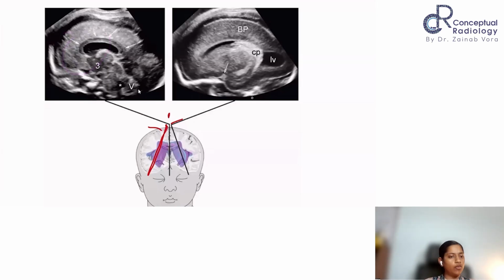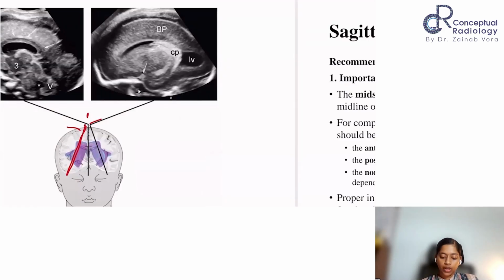Very good. So anterior fontanelle or sagittal suture. Now this is through the sagittal suture. See, they have applied slight pressure. When you focus, there is indentation of the bone. So anterior fontanelle or sagittal. The anterior fontanelle will give you very good images. Sagittal will give you a broad picture, again with very good imaging, and the posterior fossa is also somewhat seen. But for the posterior fossa, we'll focus through the posterior fontanelle. Then you get very good quality images.